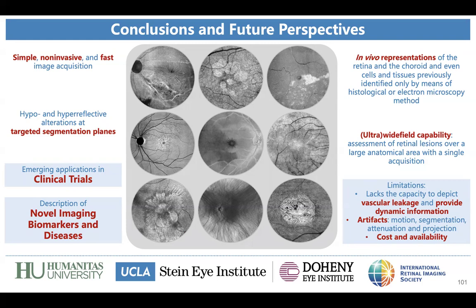However, this method has limitations, and we aim to enhance the understanding about how to decide if this information is reliable or not. I think that regarding en face imaging, it's kind of the same, but we are so aware nowadays about artifacts during OCT and OCTA acquisition that it is more intuitive to understand these artifacts.